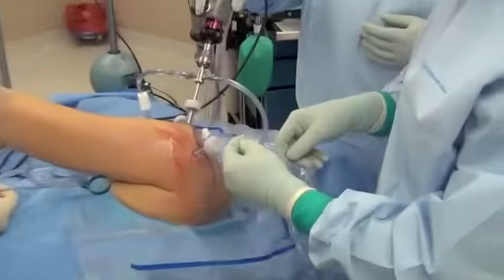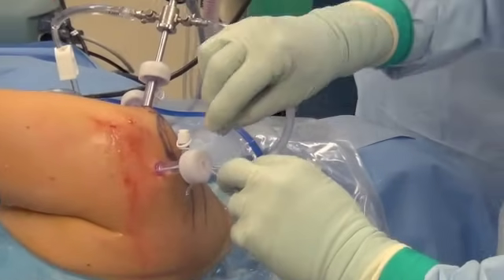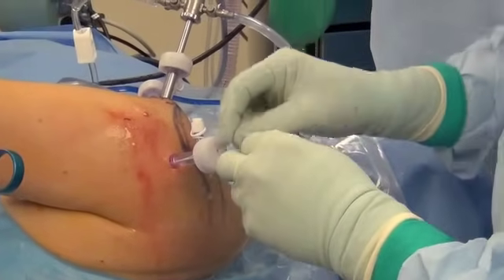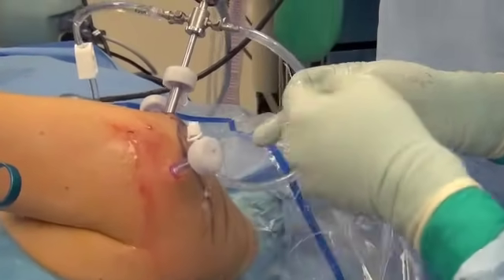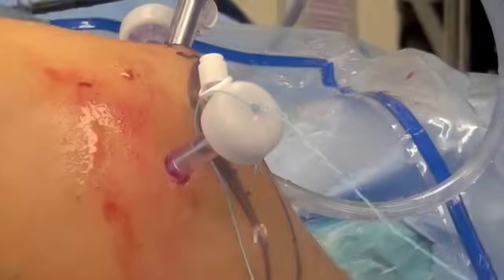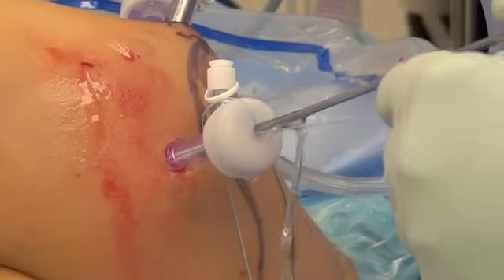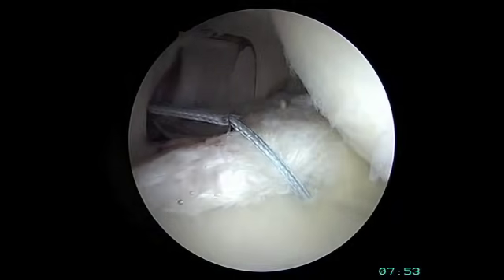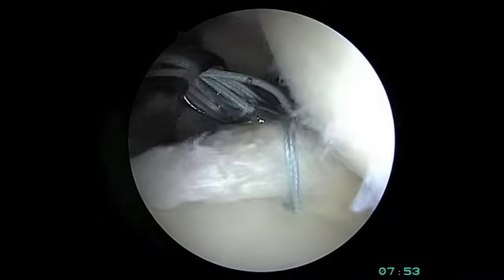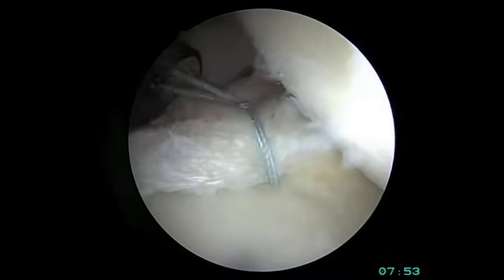With one suture through the labrum, it can now be tied down. This is a special arthroscopic slip knot that's a locking type knot. We tie knots on the outside of the shoulder and pass them down into the shoulder since this is a minimally invasive arthroscopic technique. The locking loop is created on the index finger and deployed to lock the knot, which is passed down into the shoulder joint using a knot pusher. The knot slides into place, the labrum is re-tensioned to the bone in a taut fashion, and the locking loop is deployed.